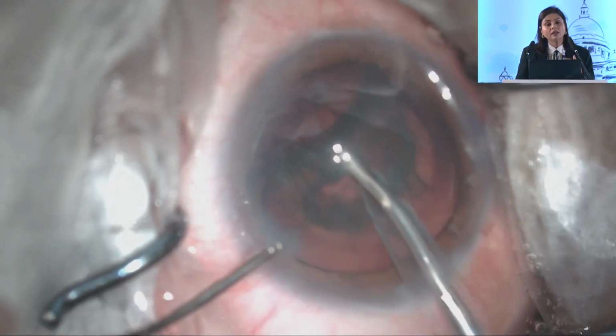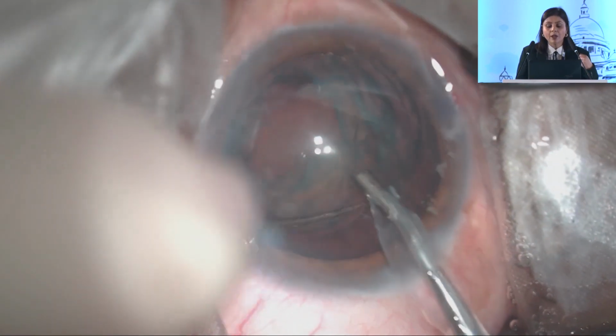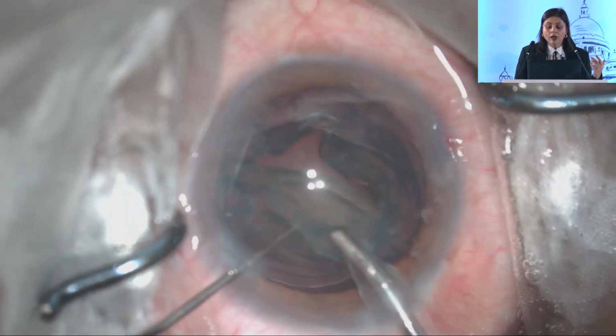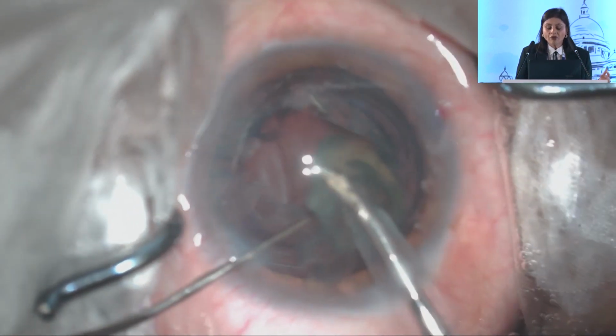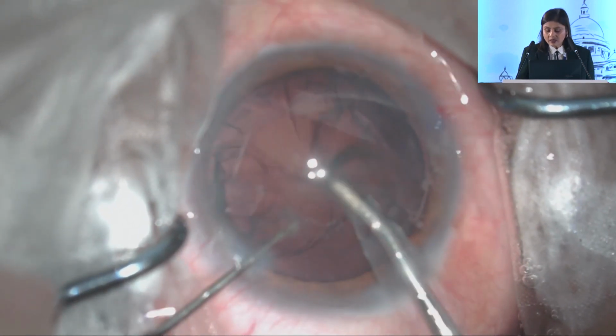So this is another technique. We can use our chopper once we have removed the anterior epinucleus to access the whole nucleus and emulsify it. And then we are going ahead now with the removal of the epinucleus plate over here and proceeding in the standard fashion.